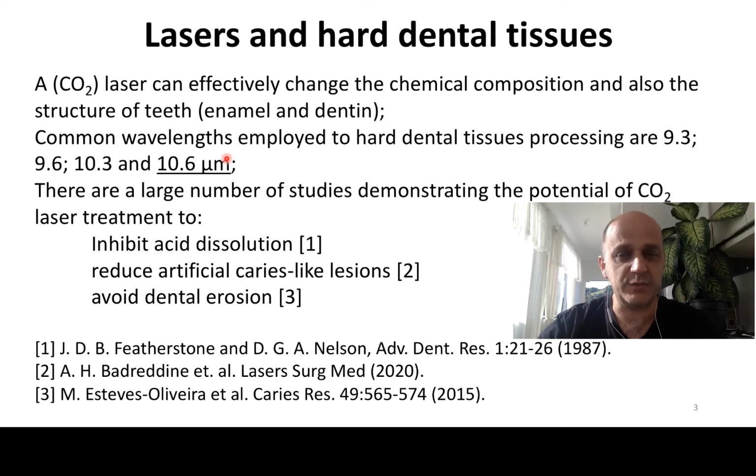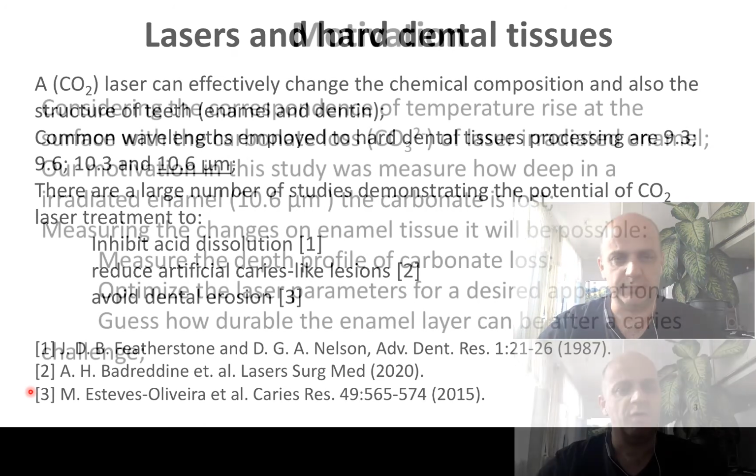For this research, we are employing only the wavelength 10.6, but remember that typical wavelengths for carbon dioxide laser are 9.3, 9.6, 10.3, and also 10.6, the wavelength that we are using in this study. There is a large number of studies demonstrating the potential of these wavelengths to inhibit acid dissolution, to reduce artificial caries-like lesions, or also avoid dental erosions. Here we have 3 references, but there is a large number in the literature.